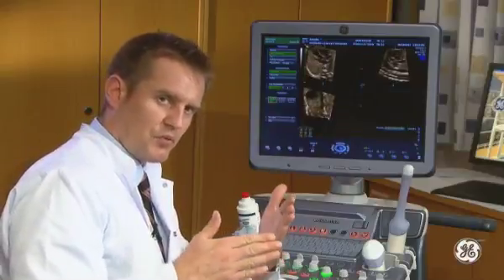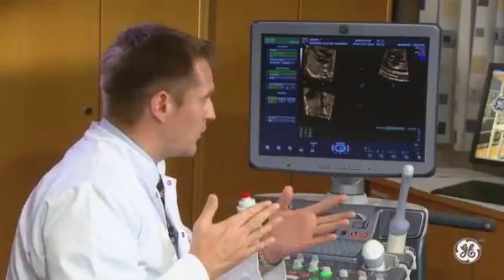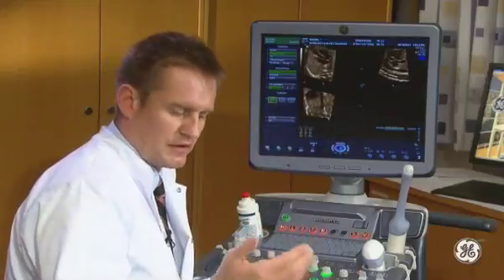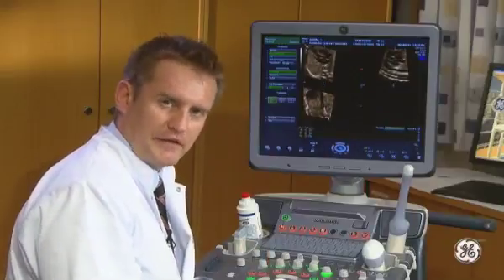We'll bring the pivot point to the level of the heart, and we'll look at the cardiac views. We'll use the multiplanar view first. Afterwards, we'll change to tomographic imaging, and finally to rendering.